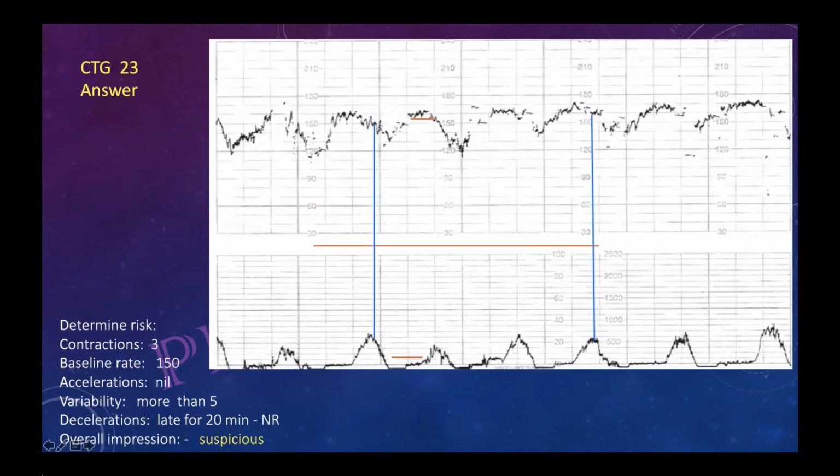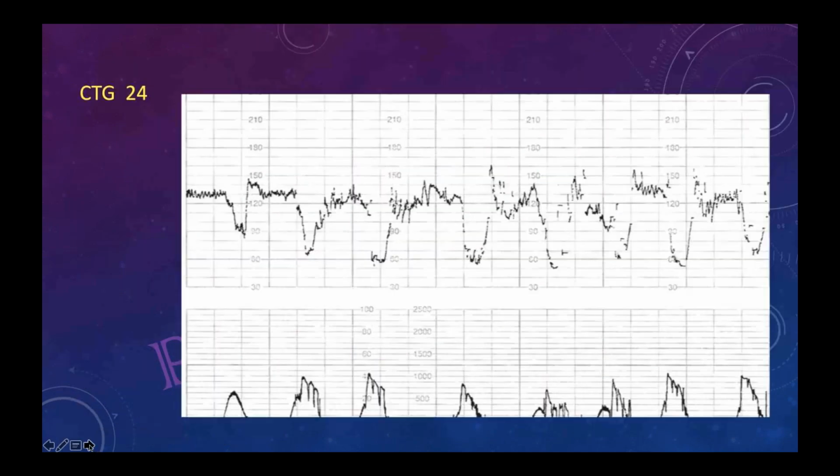Okay, we have done this test, number 23. Who will do 24? Who will do? Can I take it? Yeah.